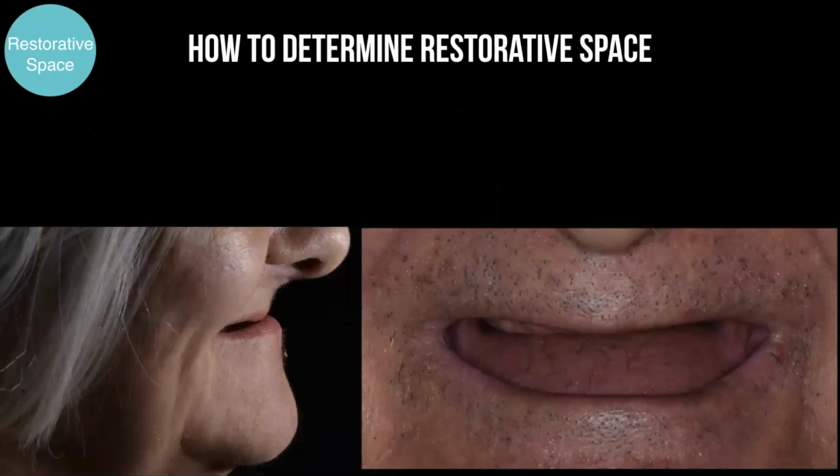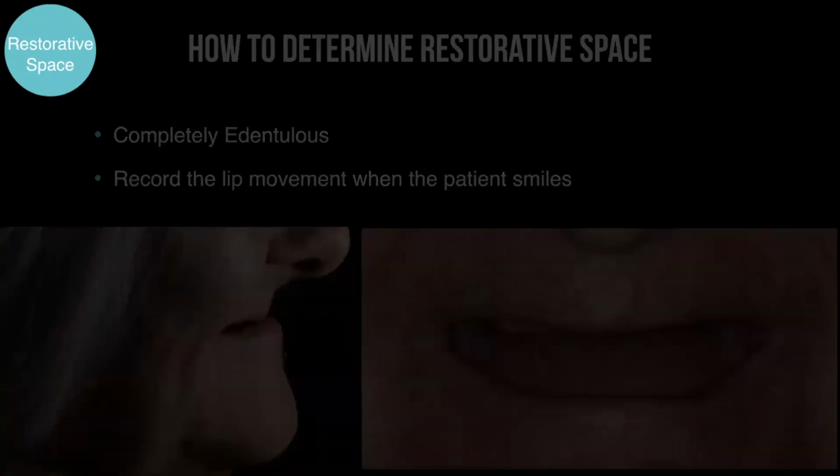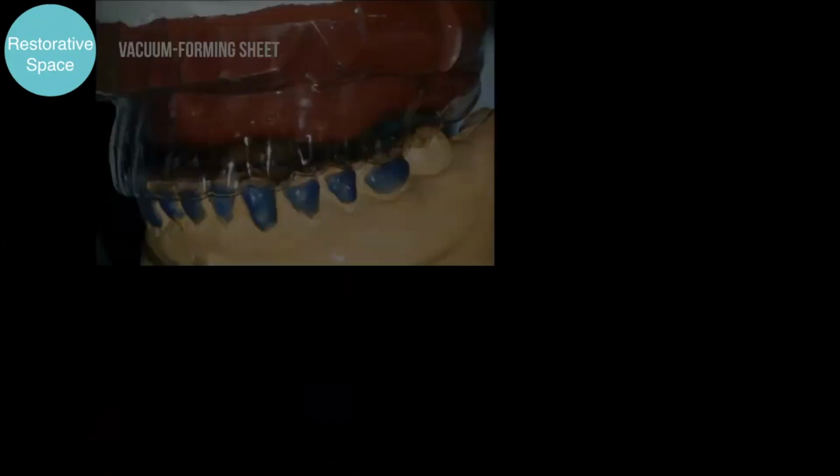Also, when the patient is edentulous, you can record the patient's movements. You can ask the patient to smile and to talk to you to see how they normally talk, and look at rest. Do you see the ridges too close or too far? You estimate how much space is left. Then when you proceed with the case, you have an idea that you might be able to put some implants or some attachment underneath the denture. Now it comes to some detailed assessment, then you go to the cast.